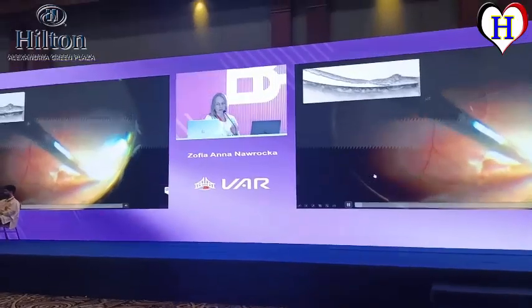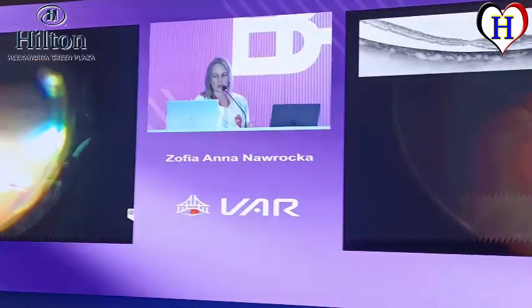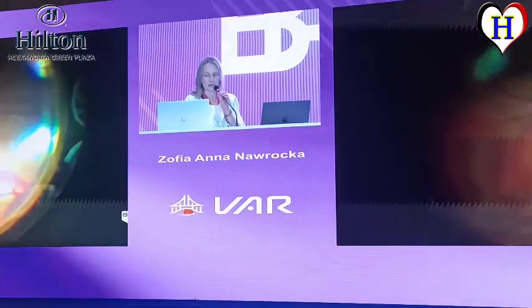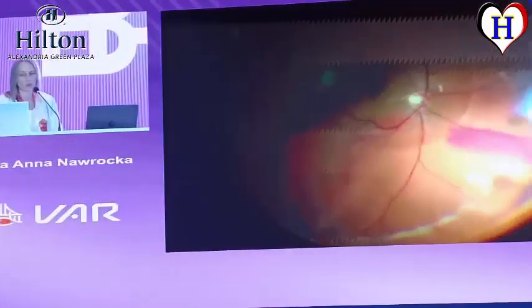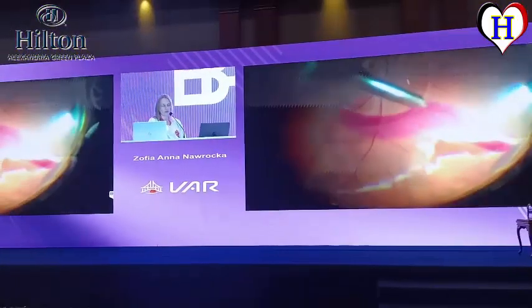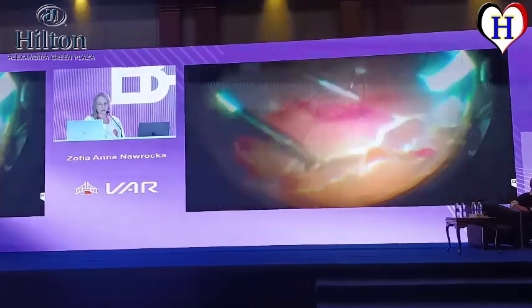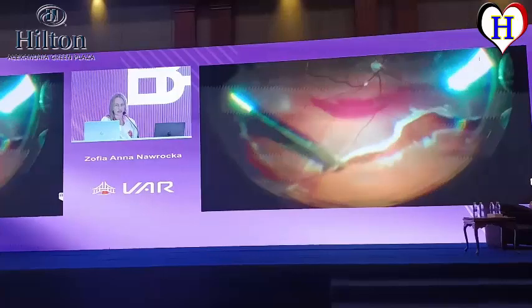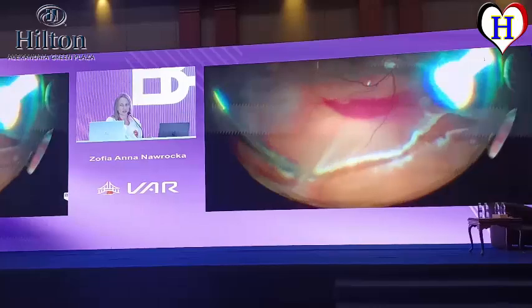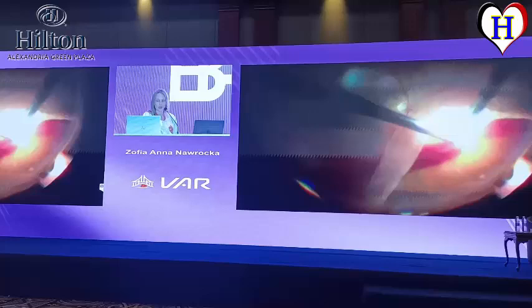A case of recurrent retinal detachment sent over for repeated surgery, and as you can see, during retinotomy, I created some subretinal bleeding, and as we know, subretinal bleeding is always a risk factor for future formation of subretinal bands. And first of all, we have to get the blood out of the fovea, so we cannot allow it to come to the fovea. Of course, to stop the bleeding, we can use diathermy, increase the intraocular pressure.